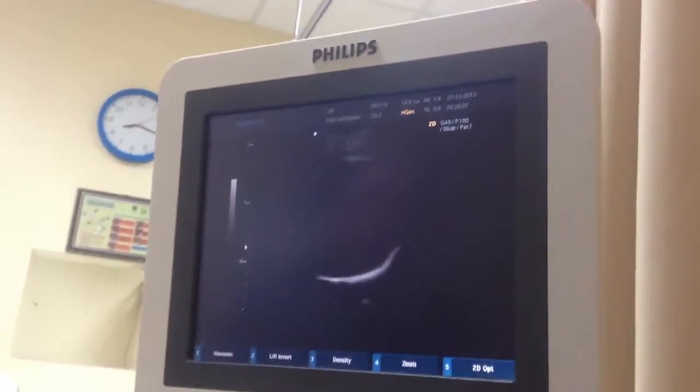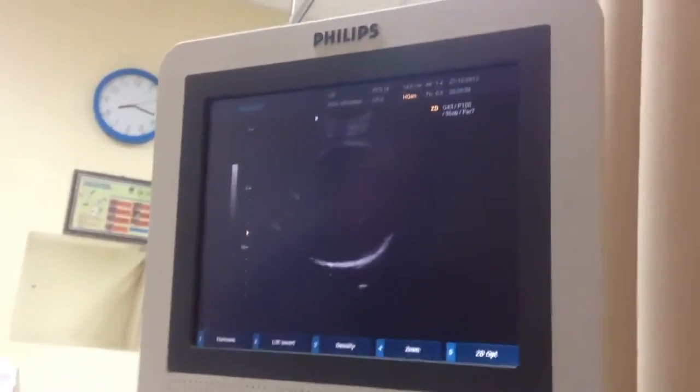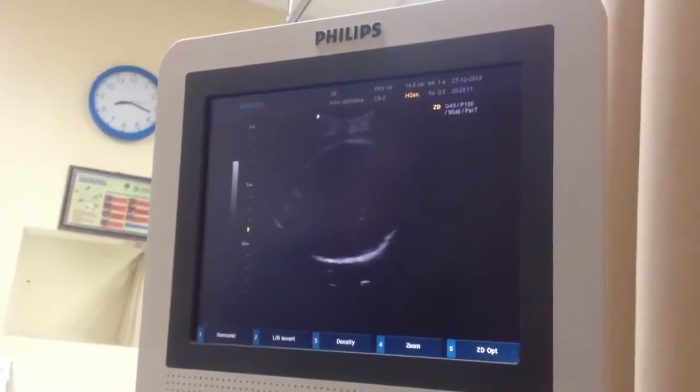This is the head. The head is only in the way. Lower than before, Doc? Lower than before.